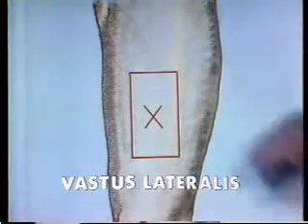The third most common site is the lateral thigh or the vastus lateralis muscle. Its boundaries are a hand's breadth below the groin and a hand's breadth above the knee. The side boundaries are from the mid-anterior thigh to the mid-lateral thigh.